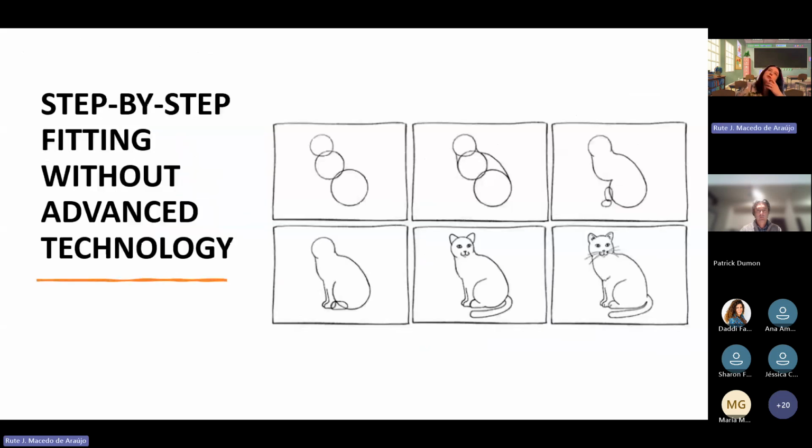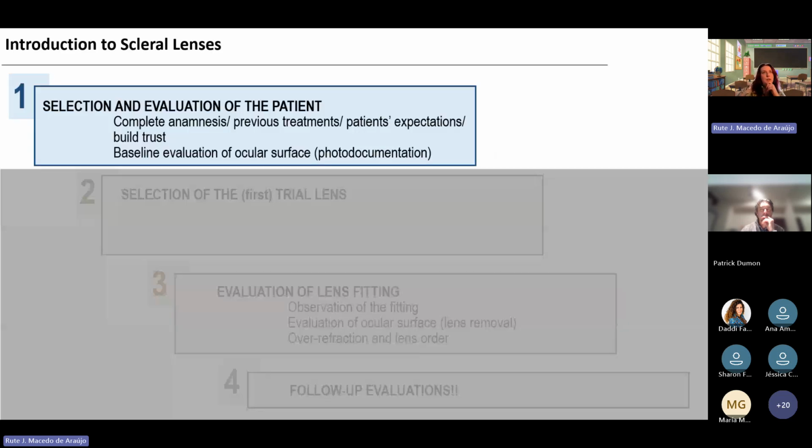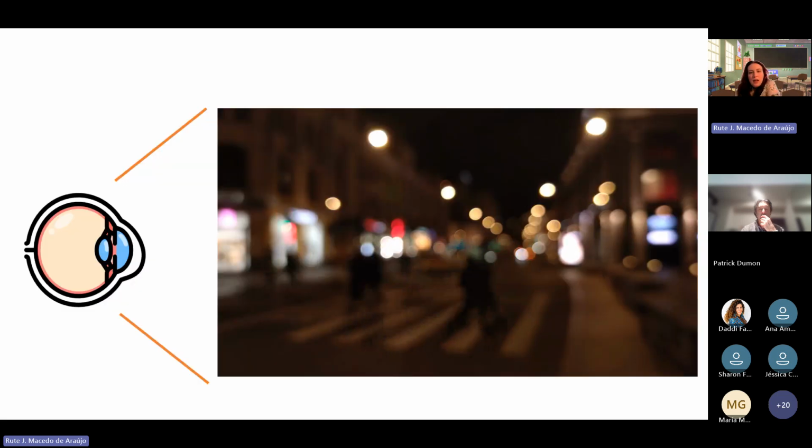Now, let's move into the step-by-step fitting without advanced technology. So this was an introduction because it's needed for those who never fitted scleral lenses to know about the implications of the things that I'll be talking about in the next slides. So step by step, we will start with the selection, or more the evaluation, of the patients for the scleral lens fitting.